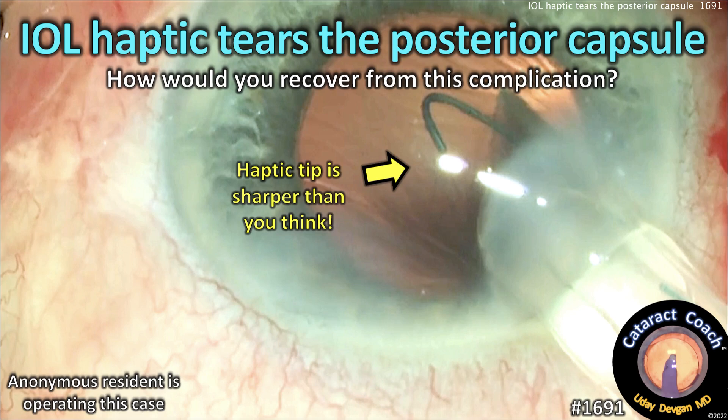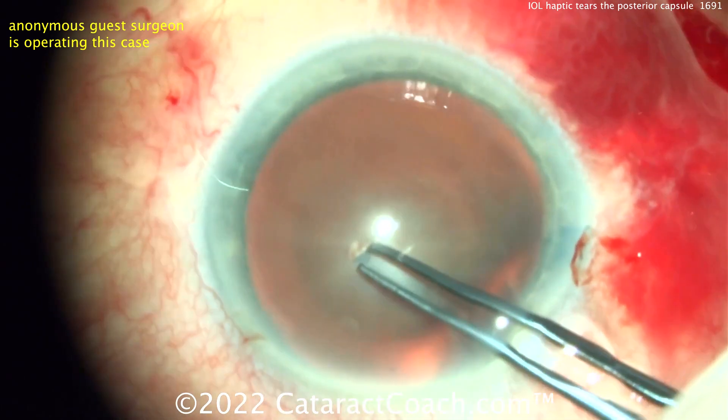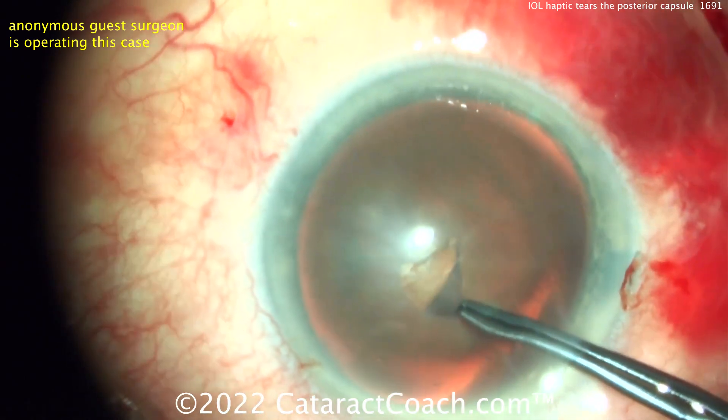Cataractcoach.com: the IOL haptic tears the posterior capsule — how would you recover from this complication? Let me show you the case. We'll start off by showing you the rhexis video, sped up a little bit.